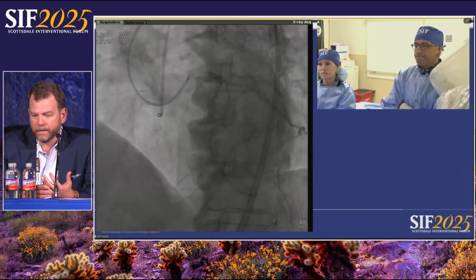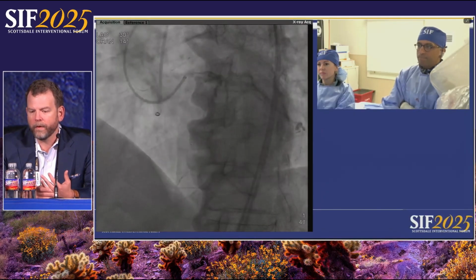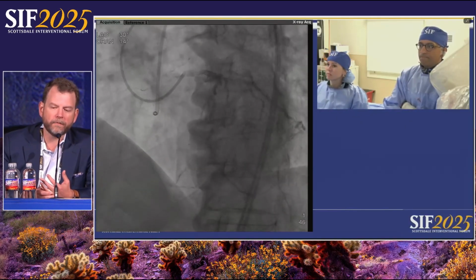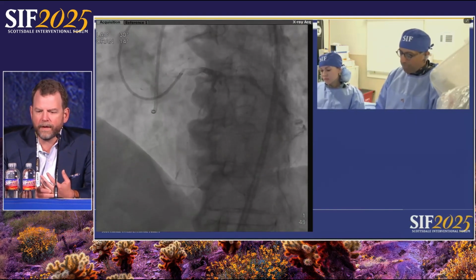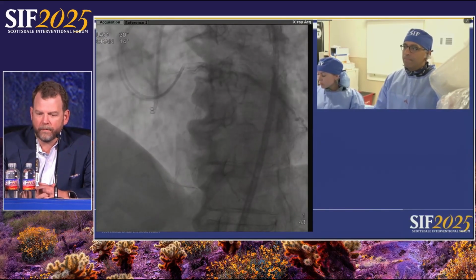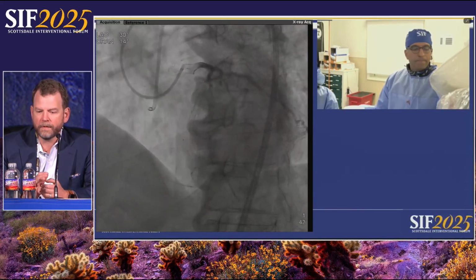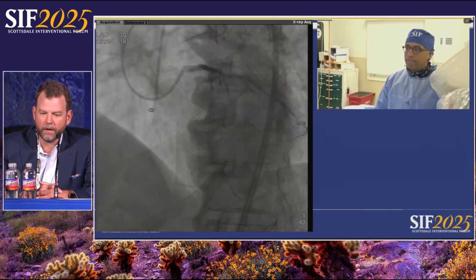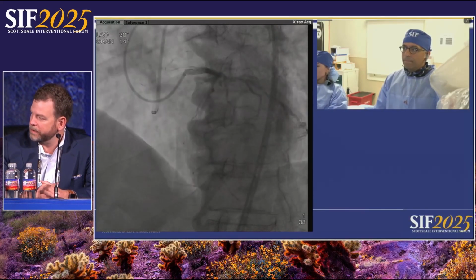What we may be seeing, there's a little bit of streaming down there in the mid-vessel, but I think there's a short segment CTO down there with a potential distal landing zone. And if that's the case, we've got good retrograde. Well, we've got a potential interventional collateral from the LAD. The circ stuff I'd need to investigate a little bit more. It does appear that there's an epicardial off of there, but what I would probably start off with, because I have an unambiguous proximal cap, again, with a little bit more injection on the right guide to make sure, is AWE with an ADR bailout, with a septal as a third and potentially an epicardial as a fourth. Although you could argue whether that epicardial as a fourth should be a fourth versus a star strategy.